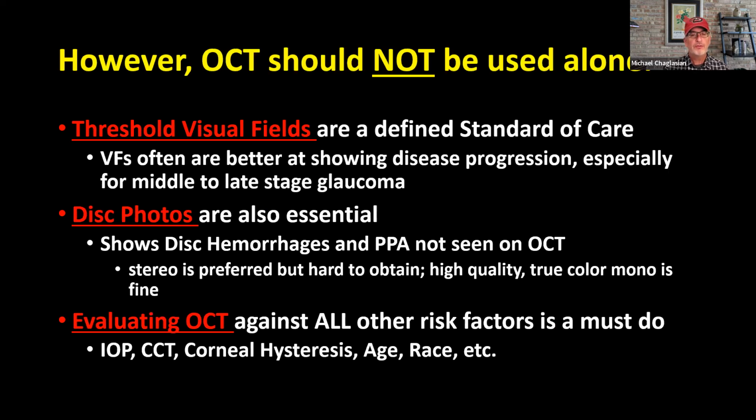And of course, then your OCT, either in the office or if you're ordering it for a patient who may be consulting with someone outside the office. But visual fields are a defined standard of care. We need them even if they're normal, and you can still diagnose your patient with glaucoma with a normal visual field, and I'll show you that in a couple of minutes. And we need them down the road.